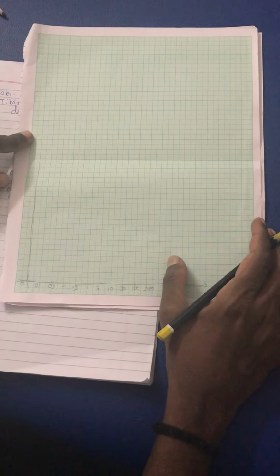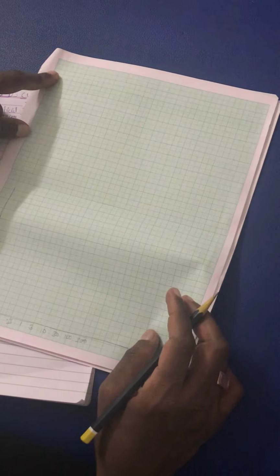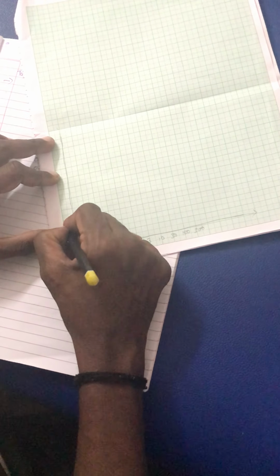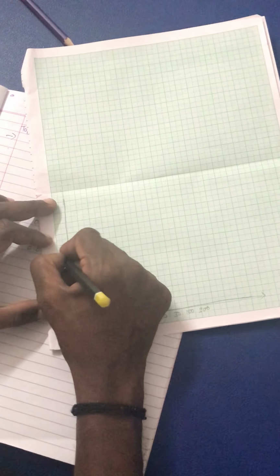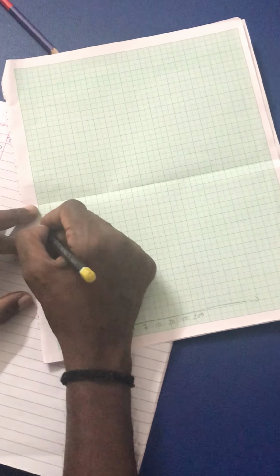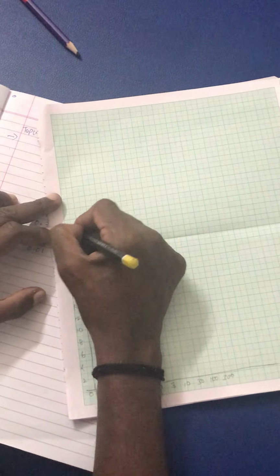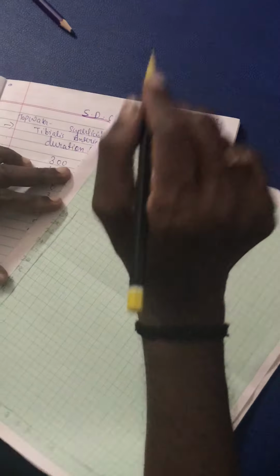Now I am going to plot the intensity, and the maximum that I have reached is 30. So I can divide the way I want. At least 15 divisions should be there, more than 15. So I will take steps of 2: 2, 4, 6, 8, 10, 12, 14, 16, 18, 20, 22, 24, 26, 28, 30. So it is going to be at least 30.